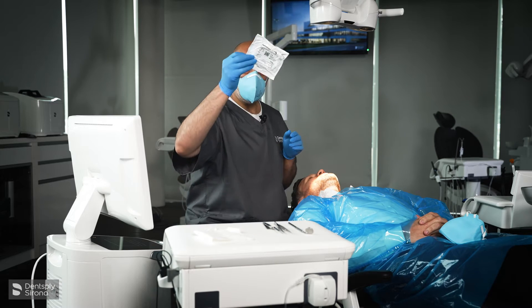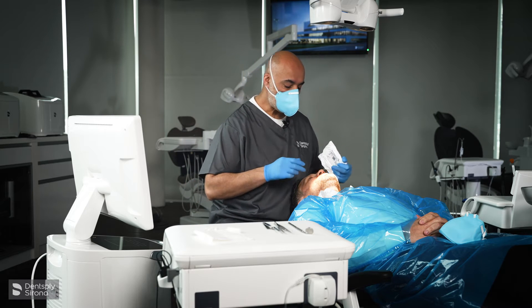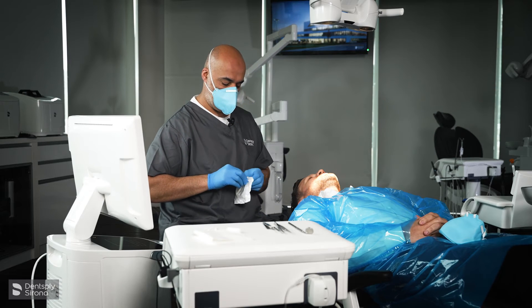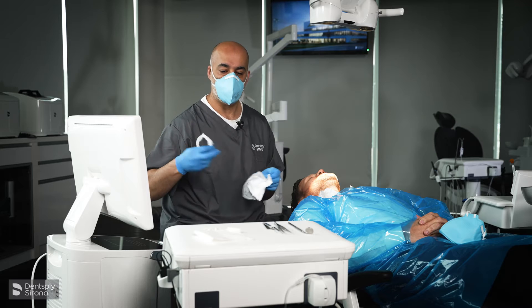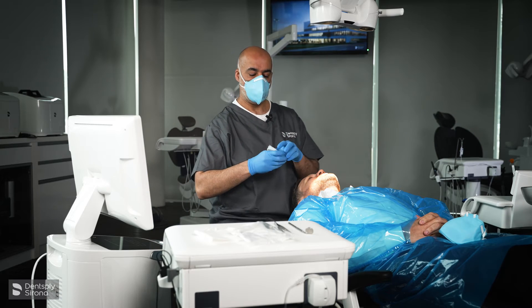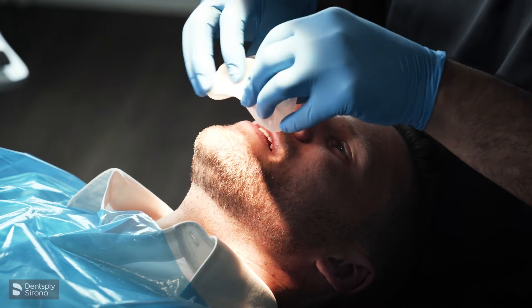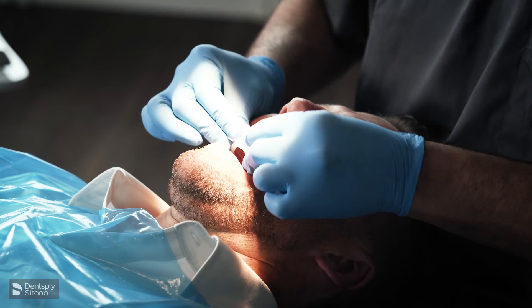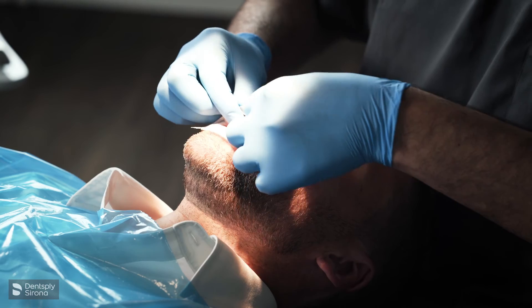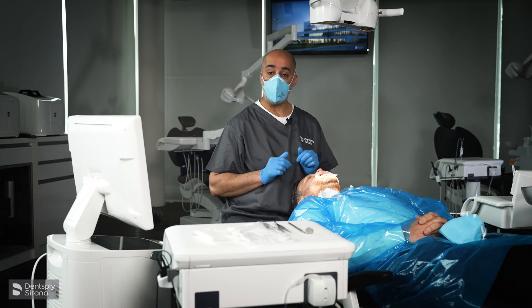First thing we're going to do is use an OptraGate to hold the tissues out of the way. We look at the size of the mouth and choose the appropriate size. We're going to place the OptraGate in between the lips and the teeth — ask the patient to open nice and wide and then relax their lips — and we drop it in between the lips and the teeth. So now we have retraction.